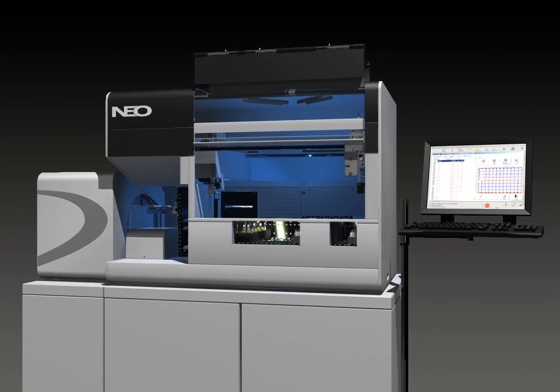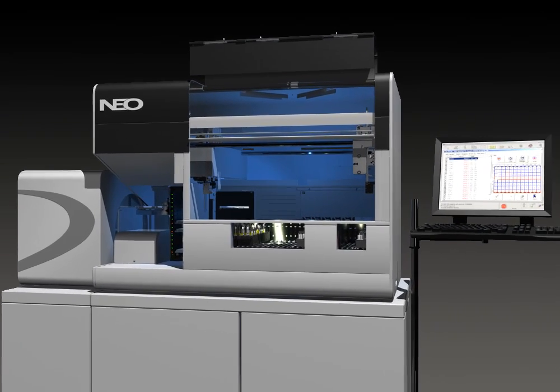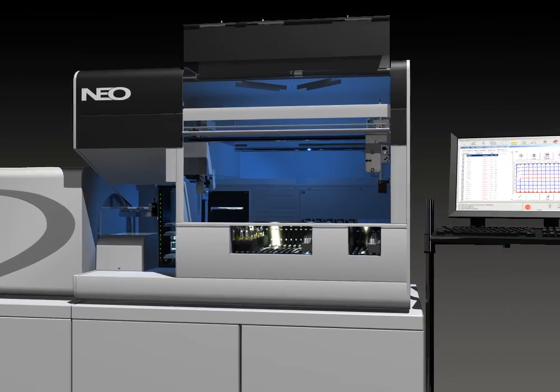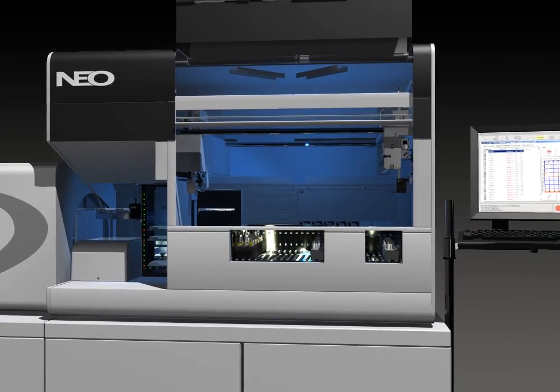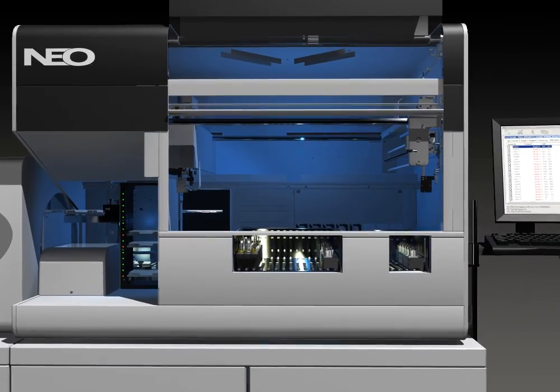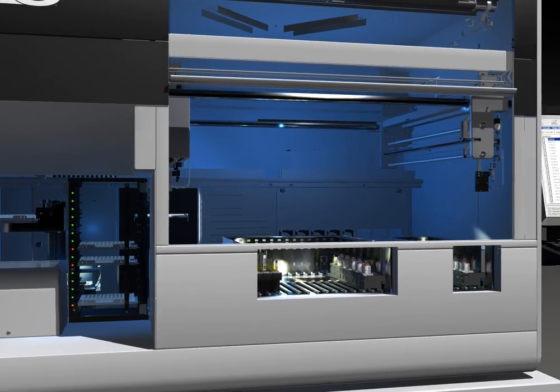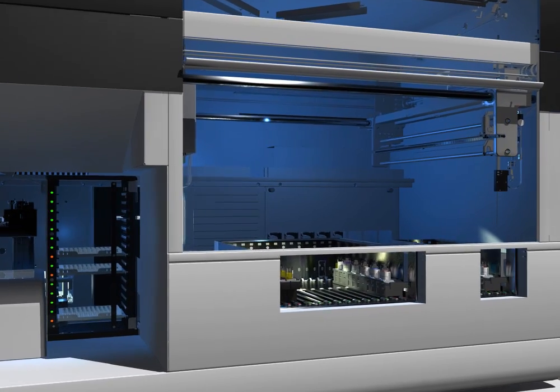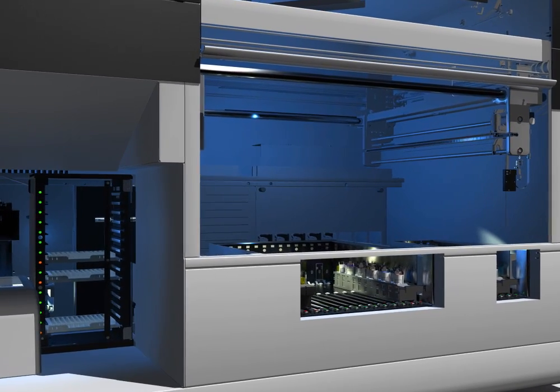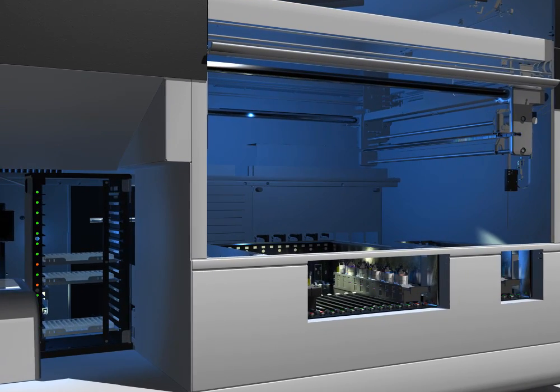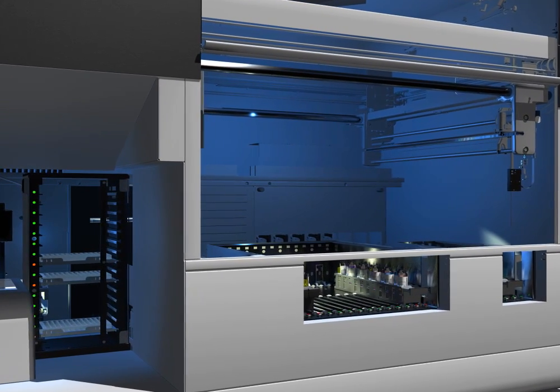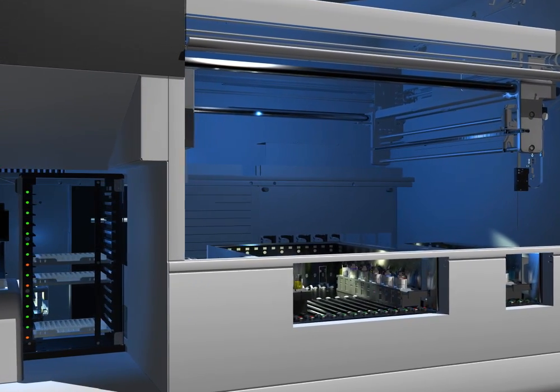NEO is a floor model instrument. Everything is self-contained on the NEO card, including system fluidics. The only extra component is NEO's printer, which can sit next to the instrument on a workbench or on the floor.